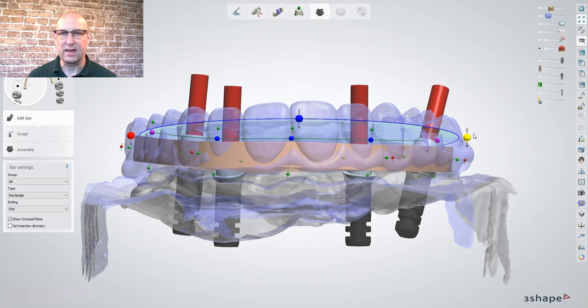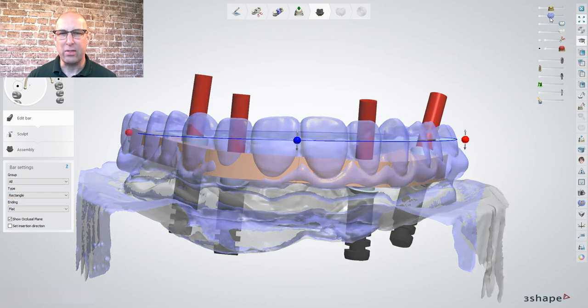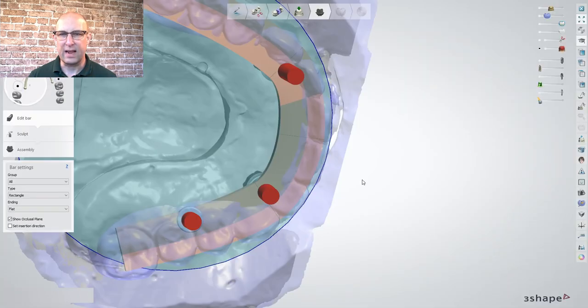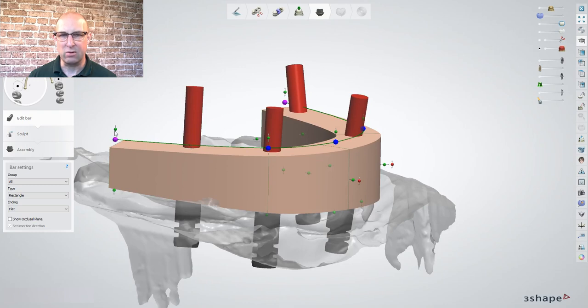While holding shift, select one of the green dots and pull the bar until it overlaps the lingual cusp of the posterior teeth. Do the same for the buccal side. Then activate the occlusal plane and adjust it so it's half in the anterior contact area and in the upper third of the posterior region. Click on one of the green occlusal dots and select scale all to common plane. In case the bar is angulated wrong, it can be corrected with set insertion direction. Click shift and pull the bar down until it completely intersects the tissue. If needed, some areas can be adjusted manually for the curve of Spee or Wilson, for example.